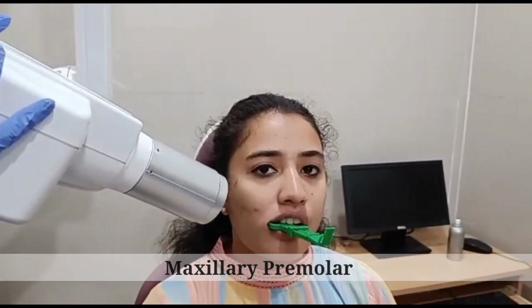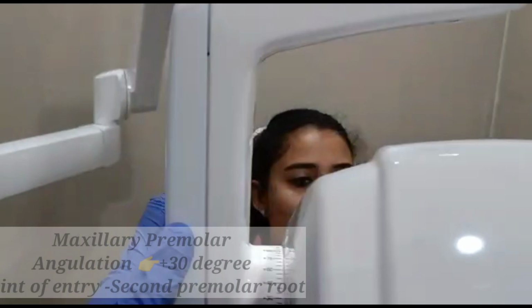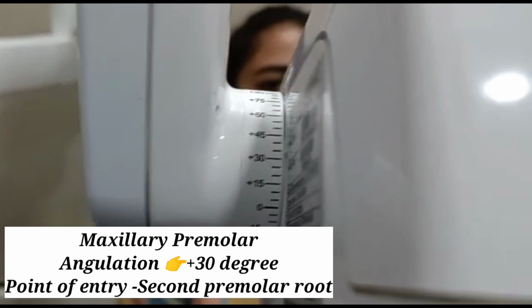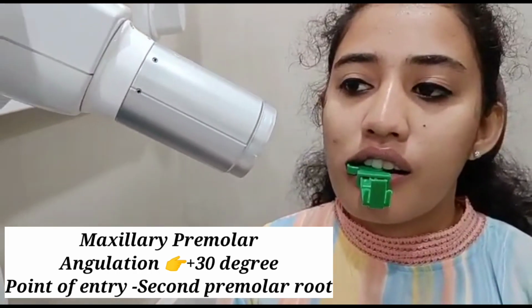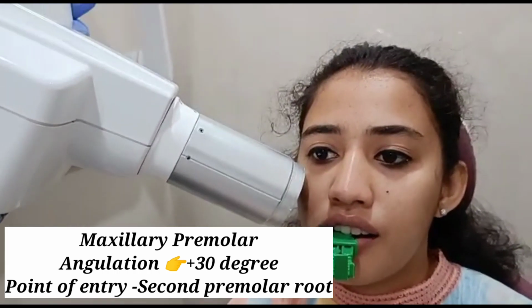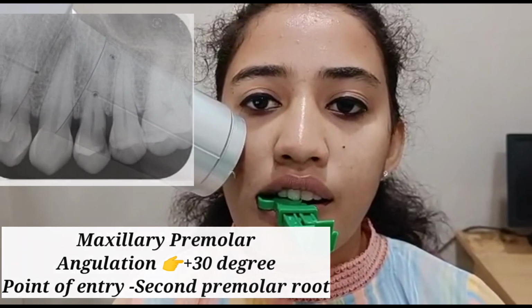And then we are placing the X-ray tube head in such a way that the point of entry passes through the center of the second premolar root, that is, it is supposed to be below the pupil, and the vertical angulation that you give is around plus 30. So we are giving the vertical angulation of plus 30, and we see that the central ray is perpendicular to the receptor and the entry point is below the pupil of the eye.